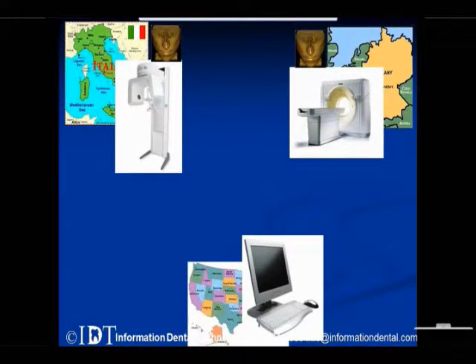And so let's say that our cone beam and our CT scan takes a scan of a patient. And so those CT scans are sent to my computer. But since my computer doesn't speak Italian or German, it's not going to be able to read that image, even though the image is there.